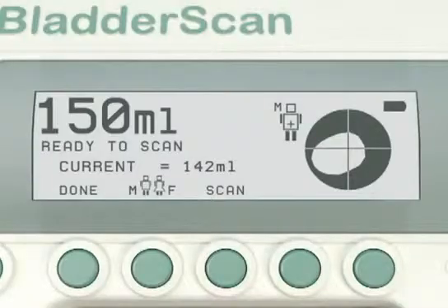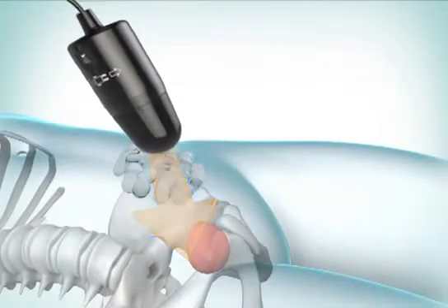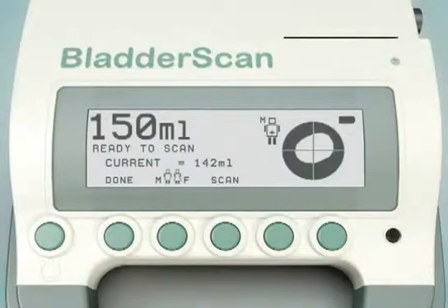For example, if the bladder image is located to the left of the icon, re-aim the probe so that it projects the ultrasound waves further to the left. Re-aim and re-scan to ensure you have captured the bladder fully inside the ultrasound cone.